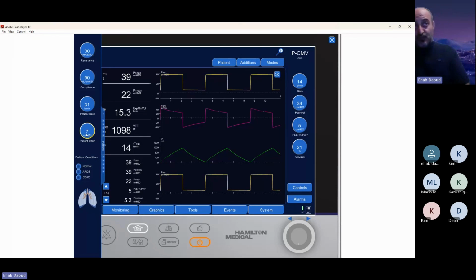But if you look at your patient with COPD or very high compliance with auto PEEP, here we go. Usually the patient wanted to breathe here. You can see this hump here. That's beautiful. Usually that's patient effort. So the ventilator should have given him the breath here. So this is a missed trigger, or ineffective trigger.